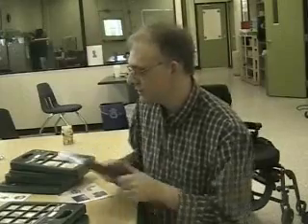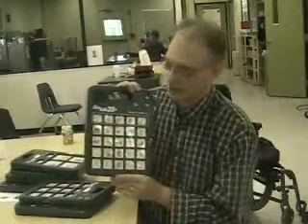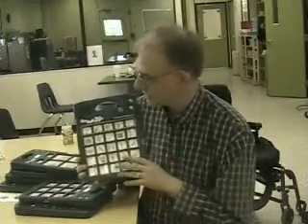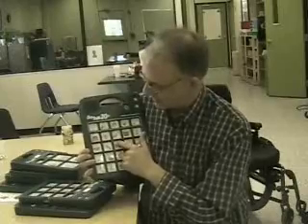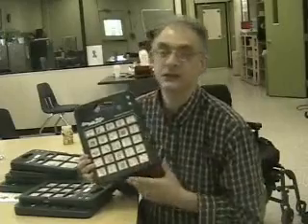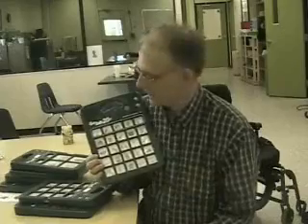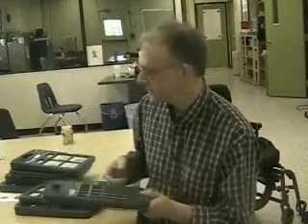As I said before, I use this with academics. In this one, I have the parts of the body here. I can use these in pairs. I can have one student talk about the parts of the body, and he'll say, "Hand." He'll say hands, and then everybody has to hold up their hands. "Finger." And everybody has to hold up their finger. So you can have a student guide other students in a Simon Says type of game using this. So it can be used for rec leisure as well as academic lessons.